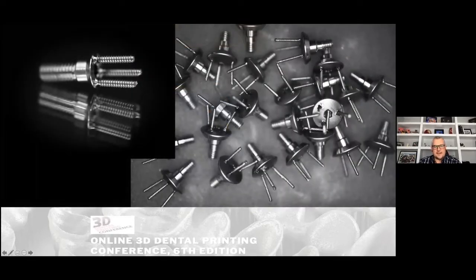So in the device space, the hardest part is to get a prototype or something to test out. And so this was our best guess, okay? It was taking existing components and putting them together and trying to come up with the concept, okay, so that we can test it further.